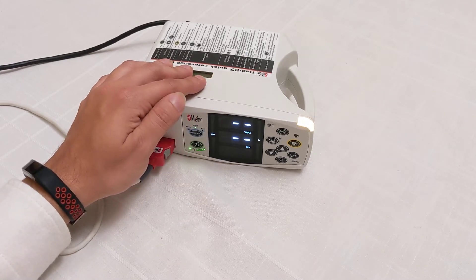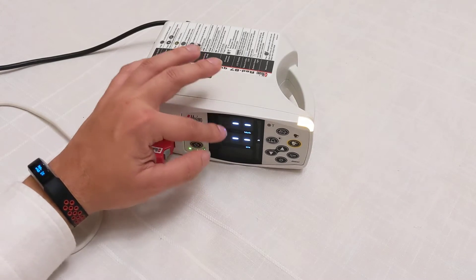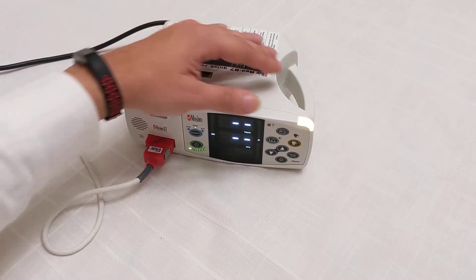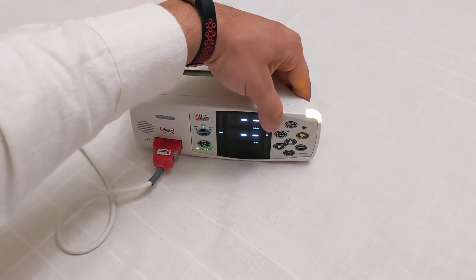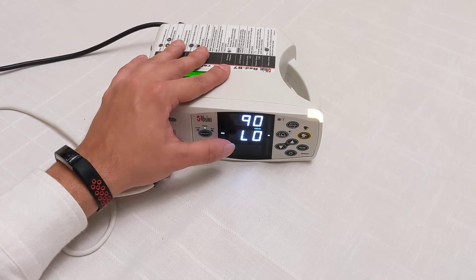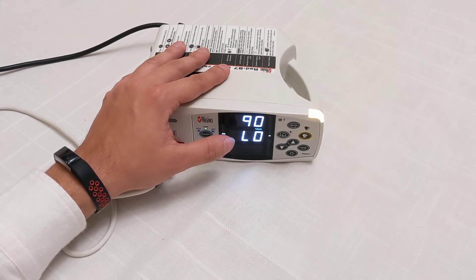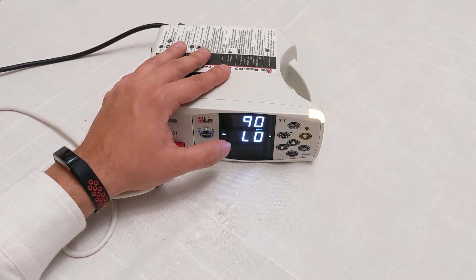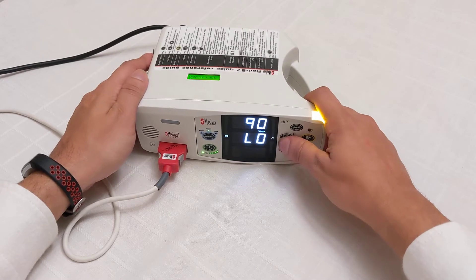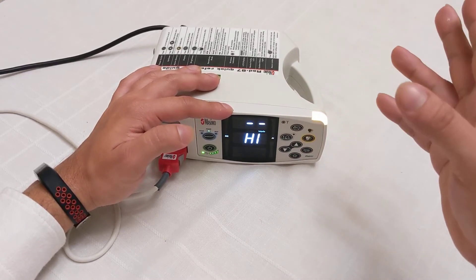There's a way to set the alarm to go off at certain percentages, and the way to do that is with this little alarm-looking button with the up and down arrows. The first one is SpO2 at 90 — that's the default for this machine. If your patient falls below 90% SpO2, the machine will begin to beep. You can adjust it by clicking the up and down arrows.